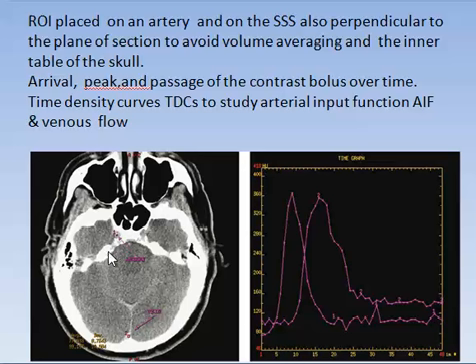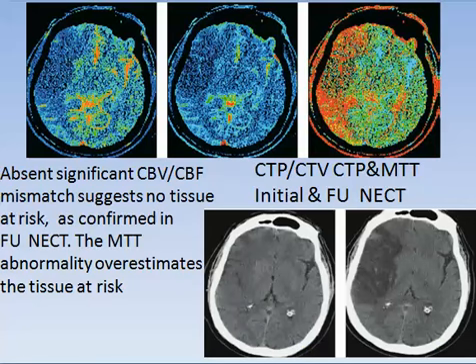This is called the arterial input function. This is again one of the procedures used from the CT angiography.